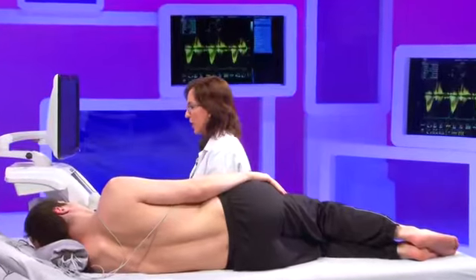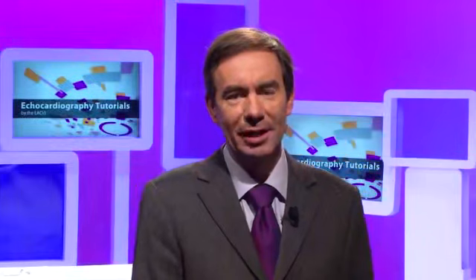Again, integrating all these findings in the clinical context and also with the information provided by 2D and 3D echo related to the size and the function of the right ventricle will help you to reach the proper conclusion about the severity of the pulmonary regurgitation. So the conclusion of this topic is that, of course, it's very challenging to assess pulmonary regurgitation, and moreover, it's very important to integrate all the different approaches and views to have a good evaluation of this pulmonary regurgitation.